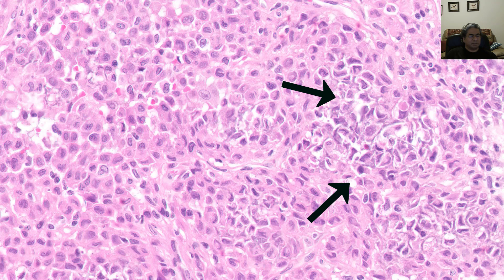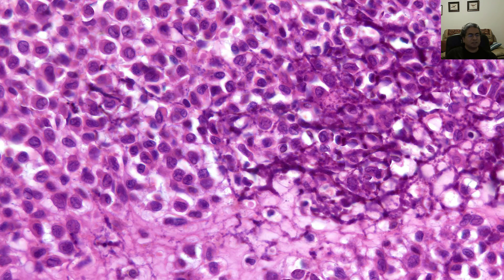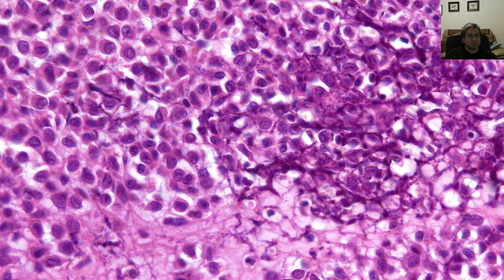Down here there's a bit of calcification — this is the so-called chicken-wire calcification. You may see it, you may not. But if you do, you're lucky; if you don't, the cells will give you the answer. If you're really lucky, you will see classic chicken-wire calcification surrounding the individual neoplastic cells.